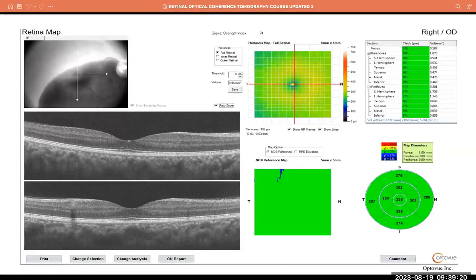There are differences in figures in Nigerian eyes, and there are differences from one machine to the other. So I would also advise that even if a patient has a scan prior to coming to seeing you or your consultant, if you're going to take over management of the patient, it's important that you do your own OCT scan.